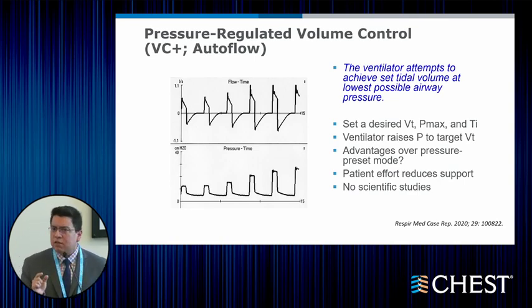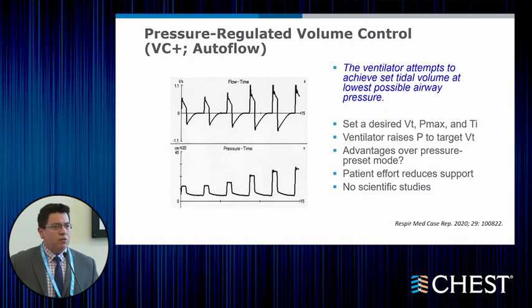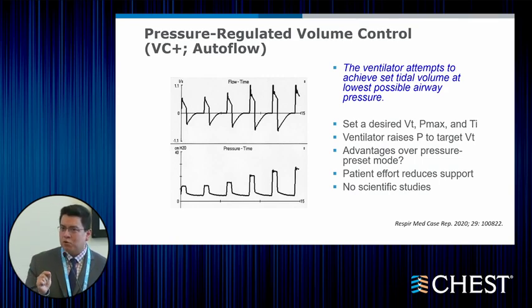And what the ventilator does is basically analyzing the previous breath based on the efforts of the patient, and the pressure is adjusted. Meaning the goal of the ventilator is to reach a specific preset amount of tidal volume using the lowest amount of pressure possible.